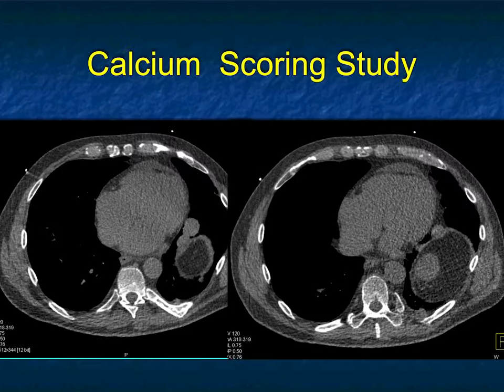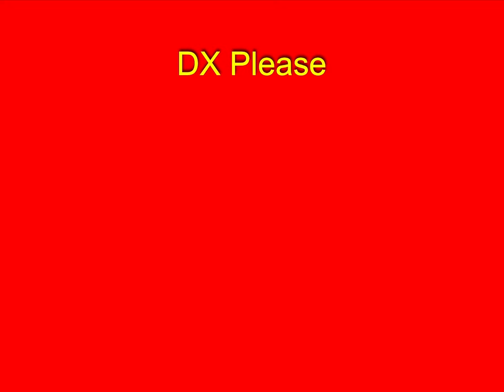This was a calcium scoring study, and we see what looks like multiple masses on the diaphragm, a mass posteriorly on the pleura, and a mass underneath the diaphragm. You can think about lung cancer implants, lymphoma — but when I got old scans, the patient had a prior splenectomy, and these were splenules, or splenosis. Post-trauma splenosis typically occurs in the splenic bed but can occur anywhere in the abdomen, on the diaphragm, or even in the lungs — we've all seen quiz cases of splenosis presenting as a solitary lung nodule.